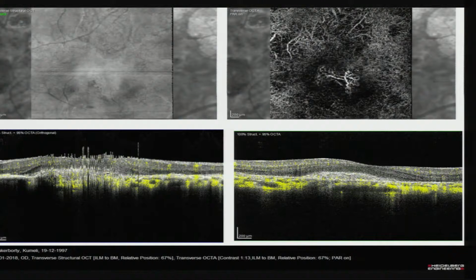The decision on treating was definitely helped by OCT angio, but I think you also gave a lot of weightage to her symptoms, like in a myopic CNVM. Many times we don't see anything objectively. We give a lot of importance to a patient who's very wise, and he says that since last week I'm getting metamorphopsia, and we tend to treat. So did you give equal weightage to her symptoms? Suppose you had seen this and the patient had no symptoms, would you treat that, or you gave 50% importance to the symptom also?